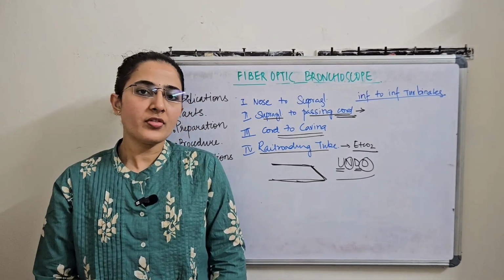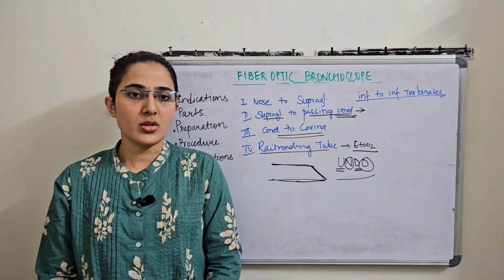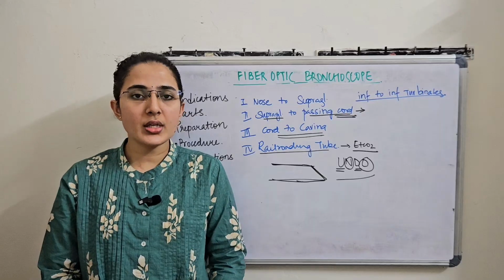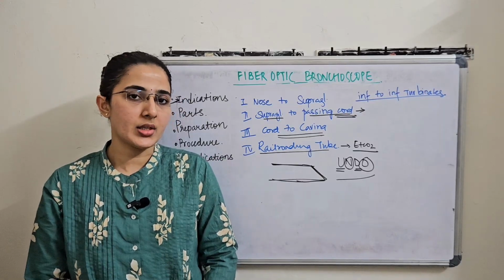Often because of excess sedation, when we are trying to visualize, the epiglottis may fall. So you can just wake up the patient or tell them to protrude the tongue for a better visualization.